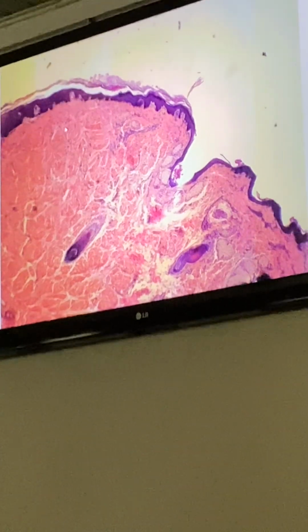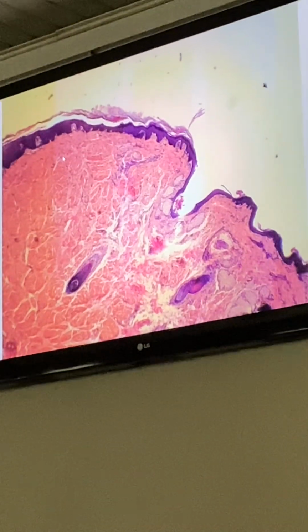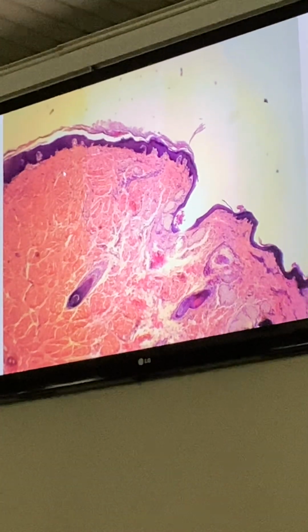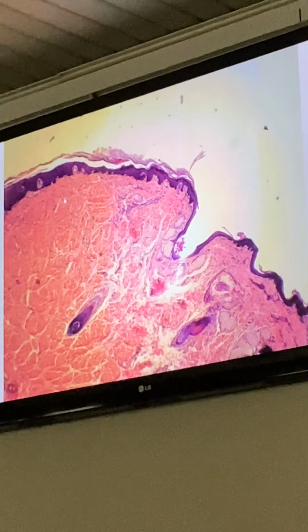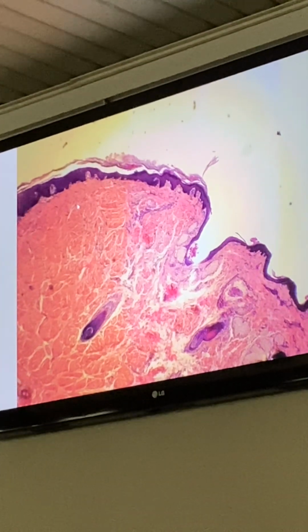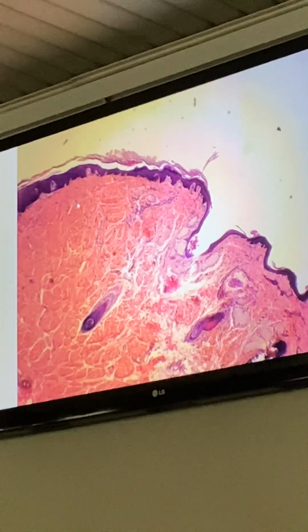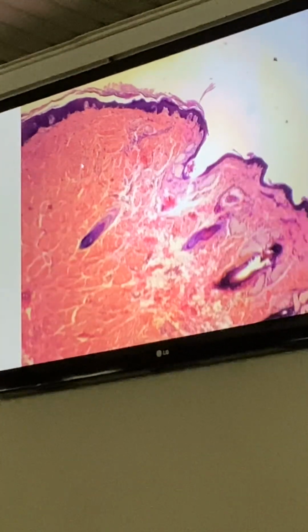Okay? Is the surface color clear? Free surface, an inner one which is mucosa, lamina propria, outer is thin skin, epidermis and dermis, containing hair follicle and the sebaceous gland, minor salivary gland which is labial gland. The transition layer between thin skin and mucosa is called red zone or red border, also called vermilion. The layer is rich with capillaries and sensory nerve cells, so it gives the pink appearance to the lips.